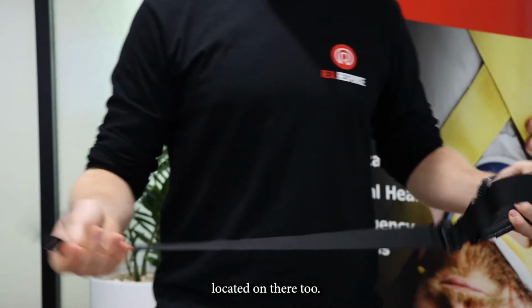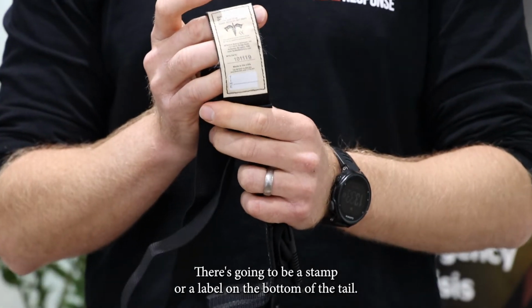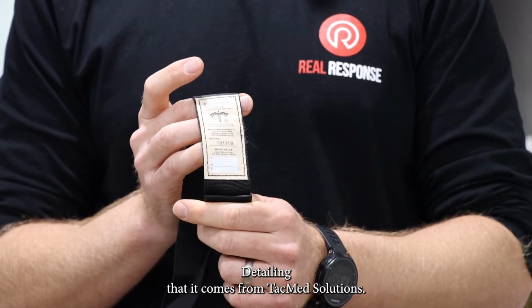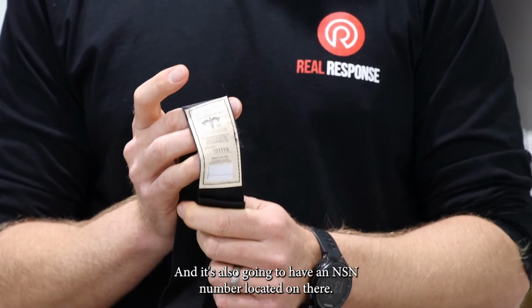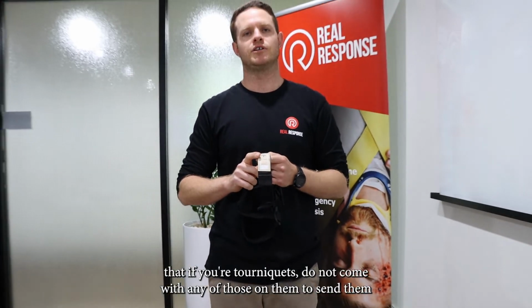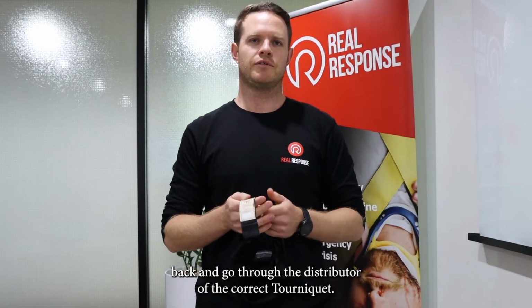With your SOFTT Wide, there's going to be a stamp or a label on the bottom of the tail detailing that it comes from TacMed Solutions, okay, and it's also going to have an NSN number located on there. I would highly advise that if your tourniquets do not come with any of those on them, just send them back and go through the distributor of the correct tourniquet.